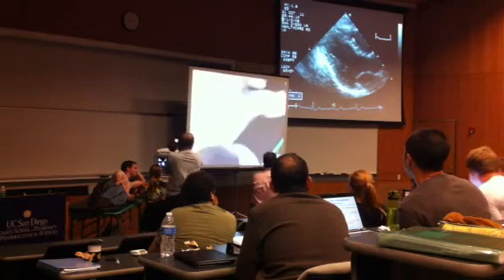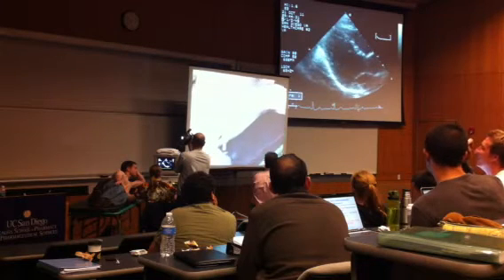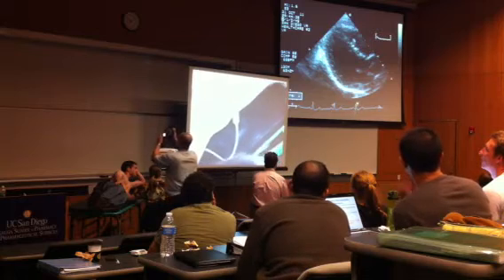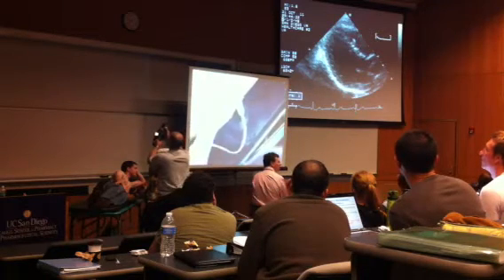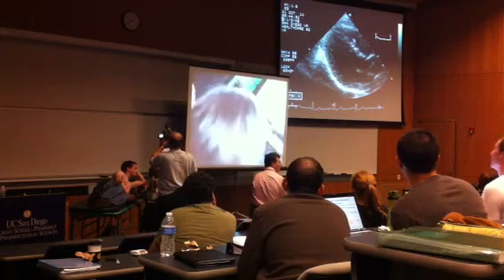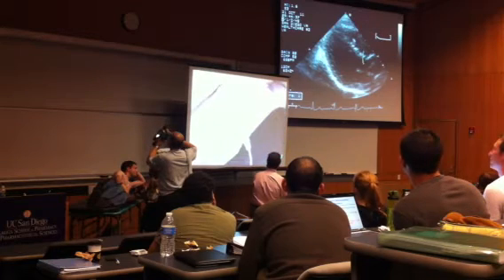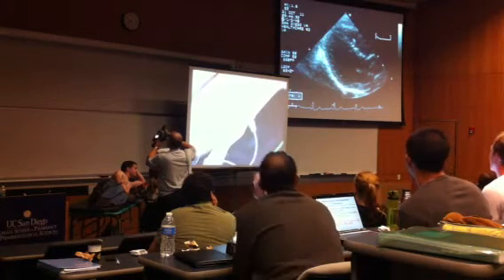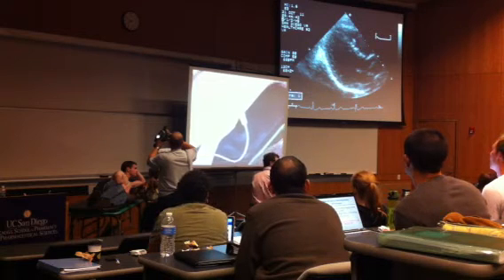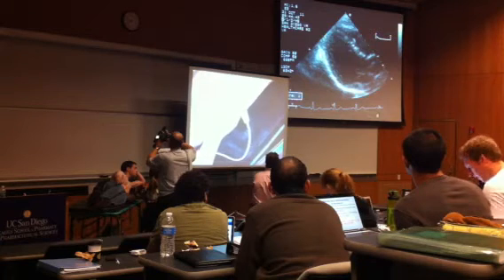Why don't you move back? Keep going back, a little more, a little more. Okay, see our cursor right here. What period of the cardiac cycle should we be in, in a general sense? Systole, diastole? End diastole, okay. So at end diastole, what do you expect the ventricular chamber size to be if we move forward? It should be maximally filled. Okay, let's move to the right.